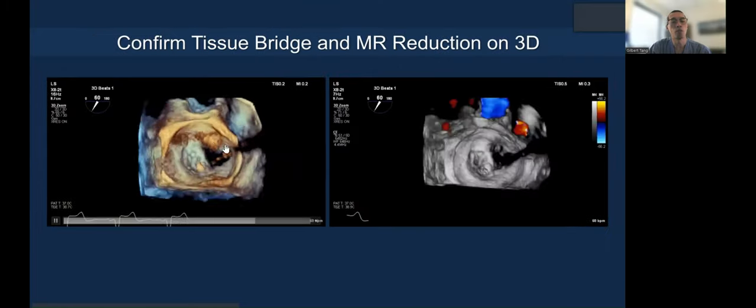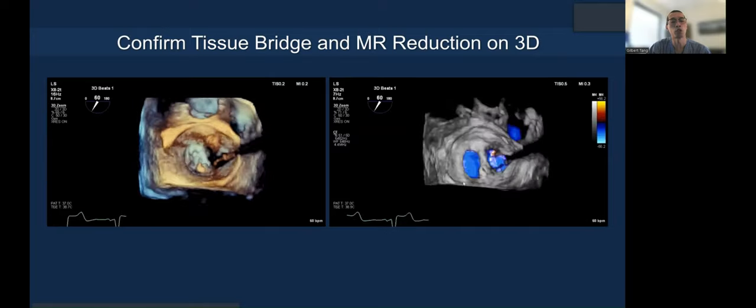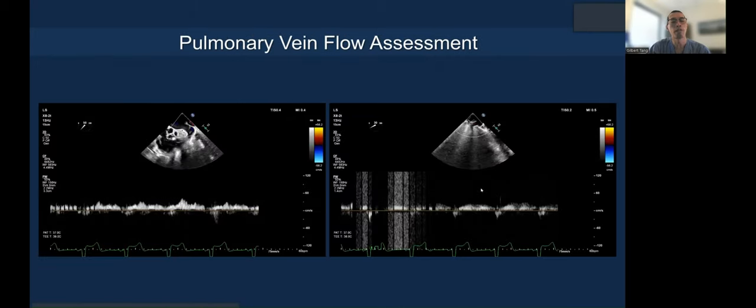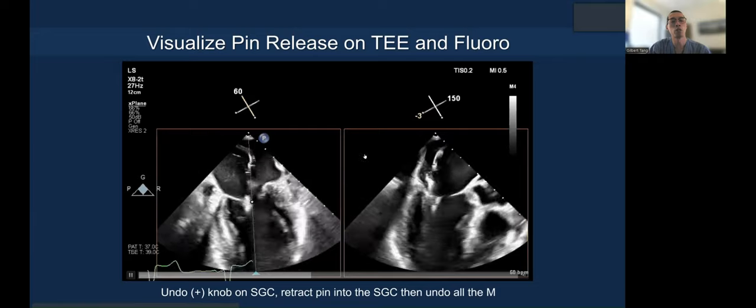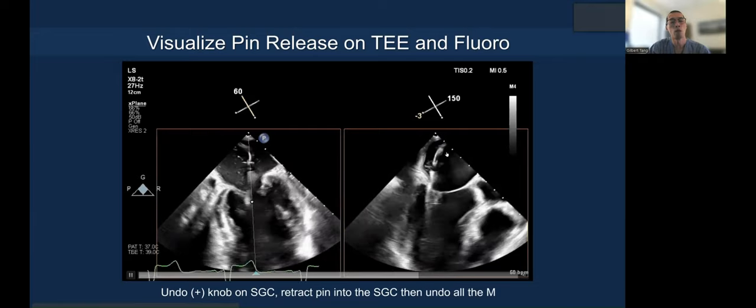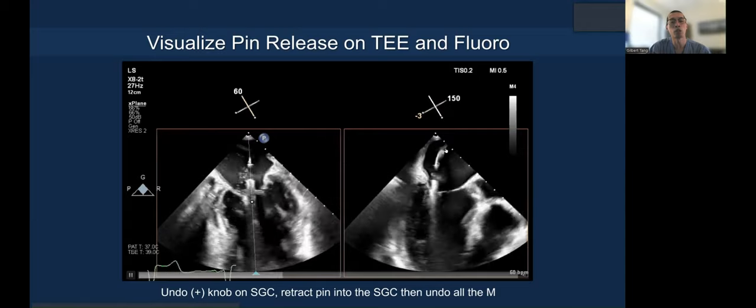A 3D en-face is very important to confirm the tissue bridge, and of course you want to make sure there's adequate MR reduction. Check the mitral valve gradient, check the pulmonary vein flow. Once you're happy and want to release, watch the pin as it comes out on fluoroscopy and echo to make sure you did not injure any adjacent structure.